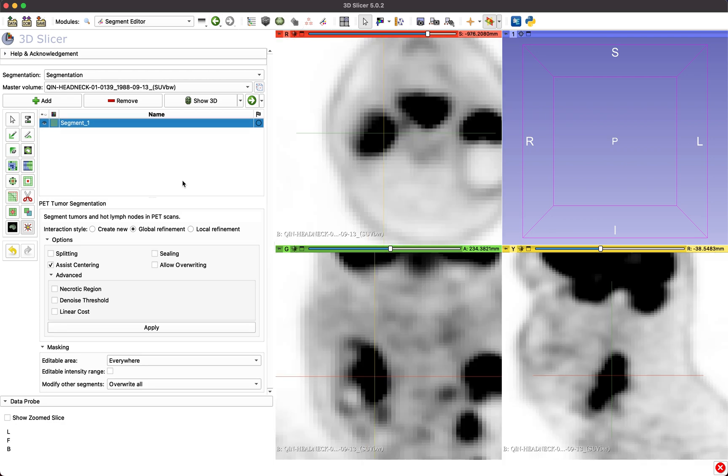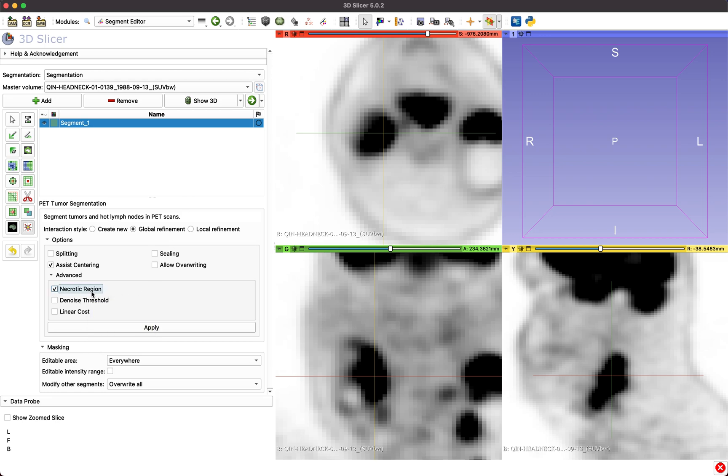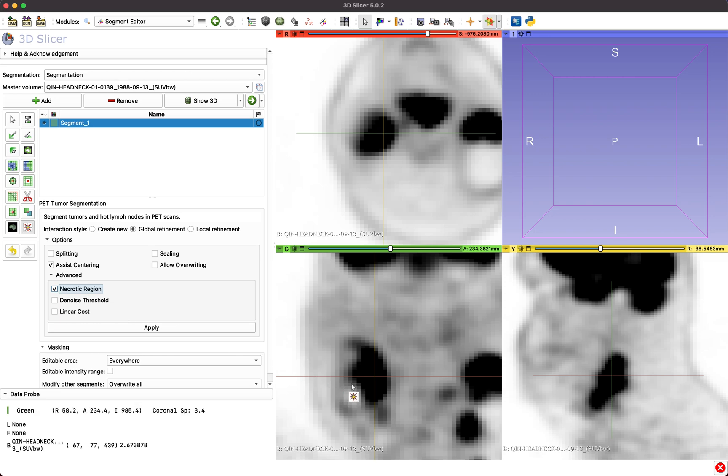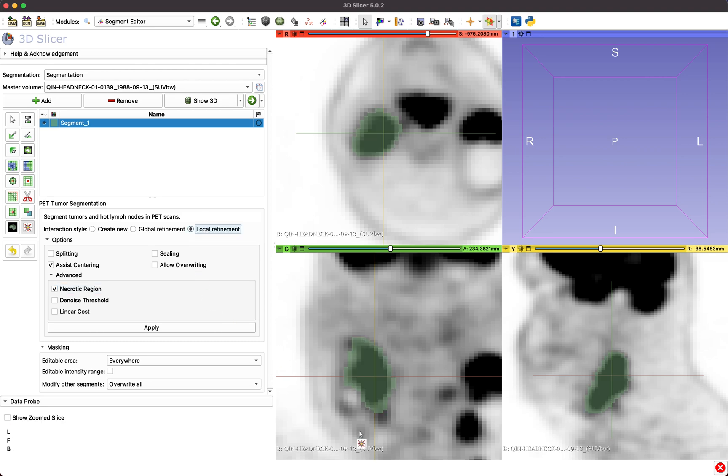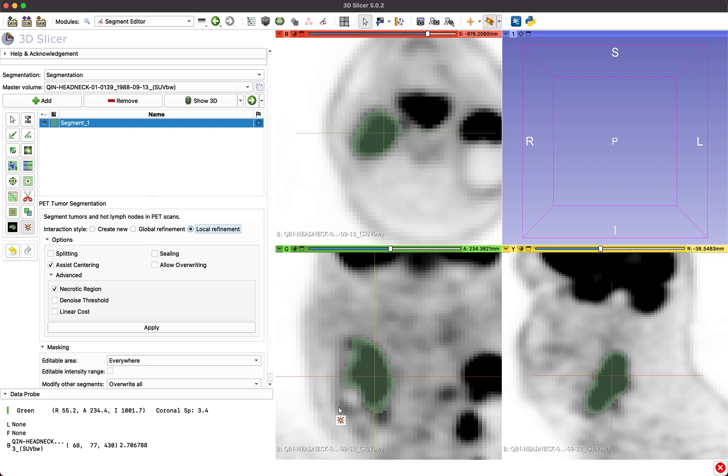There are also more advanced options that are only needed in rare cases, such as necrotic regions. Enabling this option allows placing the center point of a lesion in the necrotic part of a tumor, rather than in a high uptake region. For these kinds of tumors, more user interaction is required.